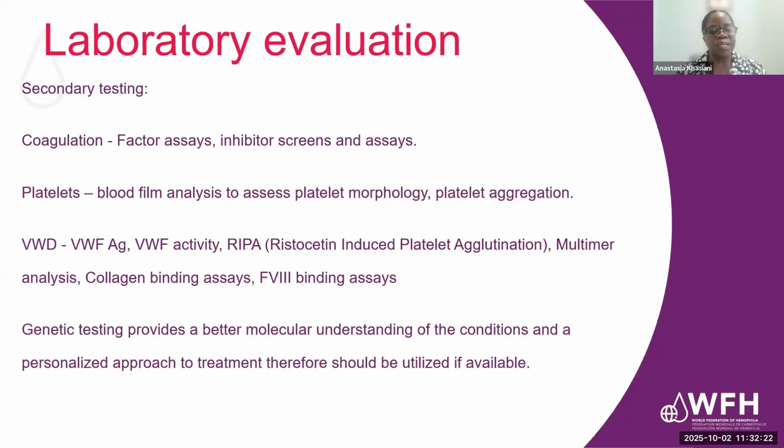In case you have platelet aggregation available to you, then this is a tool that can be utilized to study platelet function to determine whether they are acting normally or not. So the platelets are exposed to different concentrations of agonists, and their pattern of response is recorded.